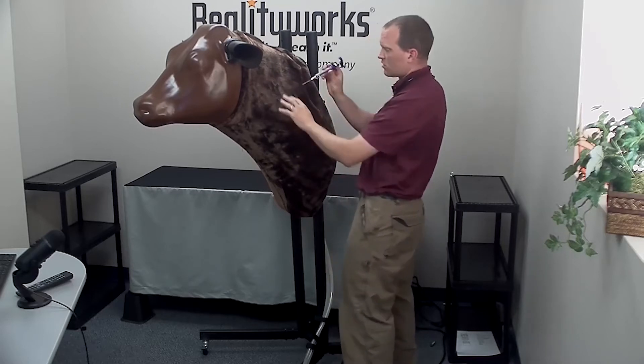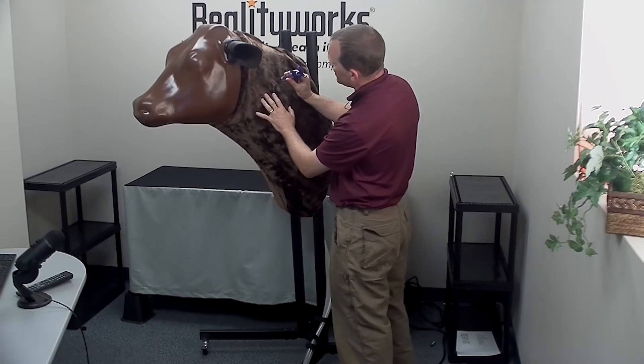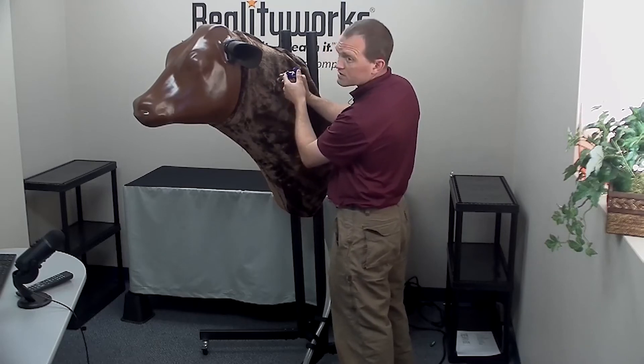For intramuscular, you will go straight in and then dispense the product.